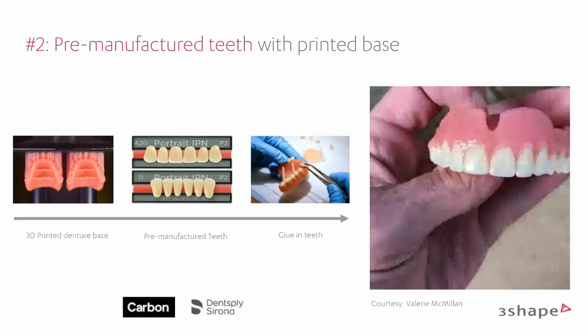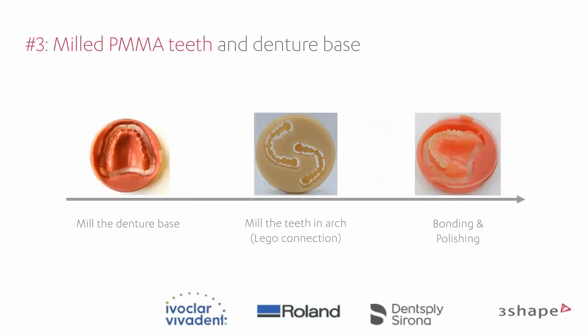Of course, the problem with denture teeth, even though these are digital denture teeth, is the usual problem we already had, that you need to grind on them if you have an antagonist. You might have to shorten them. There's still a little bit, even though they are more accurate, there's still a little bit of problems on holding the occlusion. But this is still super exciting. And of course, again, you cannot do customized teeth instantly for a copy denture. But super exciting. And the material is available only with carbon. And good point, so the material wasn't available with other printers, only the carbon printer.